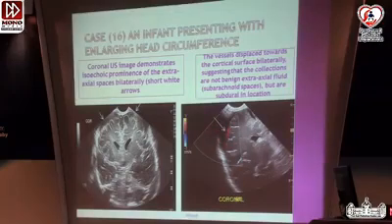Now we should answer a question. Is that subdural or subarachnoid? Because management is completely different. So we opened this color box and we found the blood vessels going towards the brain. So this is subdural. In subarachnoid, the vessels traverse the collection. Actually, sometimes I cannot make the differentiation with MRI, and ultrasound is much better. But provided that the child still has a patent anterior fontanelle.